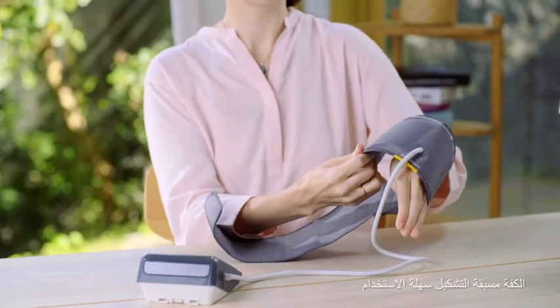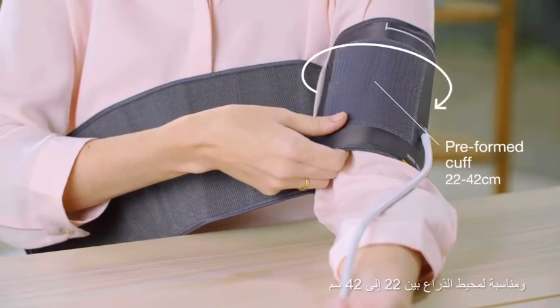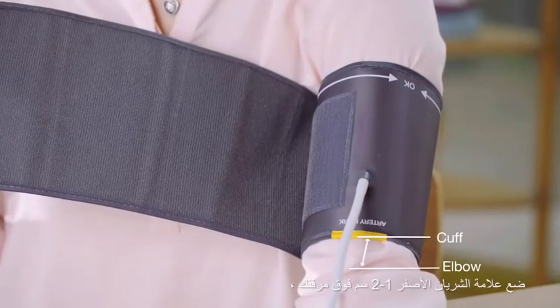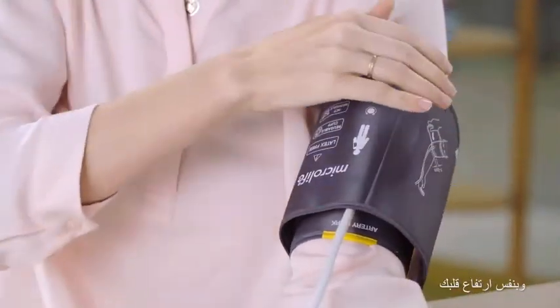The pre-shaped cuff is easy to use and suitable for arm circumferences between 22 to 42 centimeters. Position the yellow artery mark one to two centimeters above your elbow, aligned with the brachial artery and at the same height as your heart.